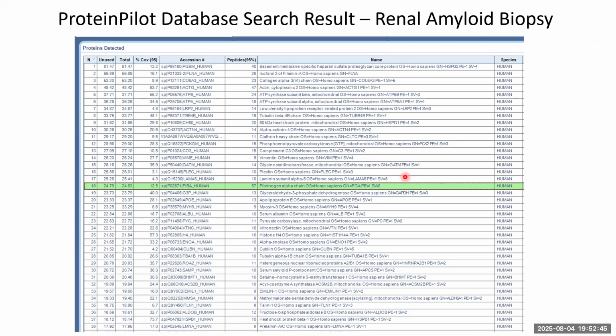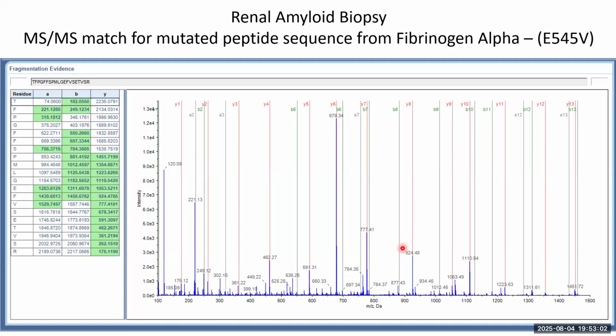A kidney biopsy from, we have this match here, number 18 on our list of proteins, fibrinogen alpha. It's a suspicious character. We know that it is possibly an amyloid-forming monomer, and we know that that's normally the case when there's a mutation. And in this data set, amongst all the peptide matches, there were a few that all pointed towards a very particular known amyloidogenic mutation.